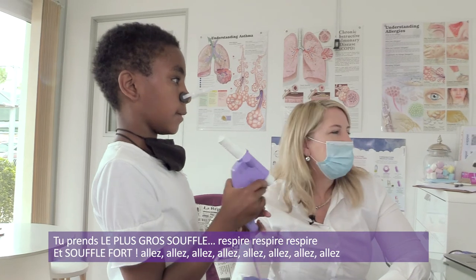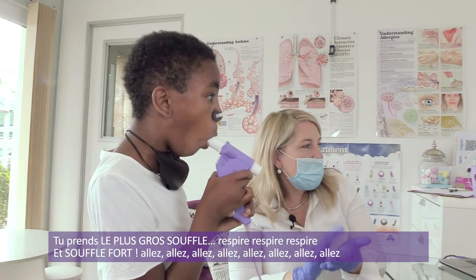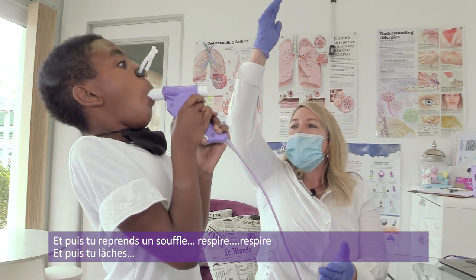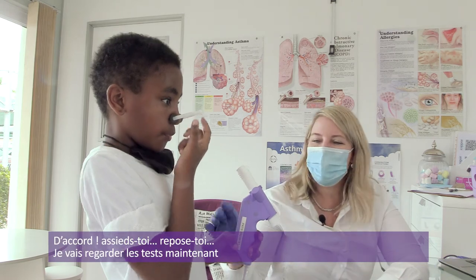All right, so your biggest breath in and fast. That's better. Go, go, go, go, go, go. And breathe in and rest. Well done. Yeah, that was a good one. Okay, sit down and relax.